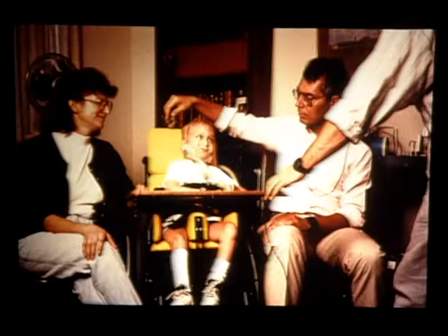You want to position the child very comfortably. This is Matthew. Matthew's position of comfort was up in his chair, being able to do things with his parents and seeing the world upright. Leo, the little videotape that I showed you, hated his wheelchair. It was very uncomfortable to him, and when we put him up in his wheelchair, he cried a lot. For him, that wasn't his position of comfort. His position of comfort was on his mat with the head of the bed elevated, and that was great for him. So position of comfort can be important.